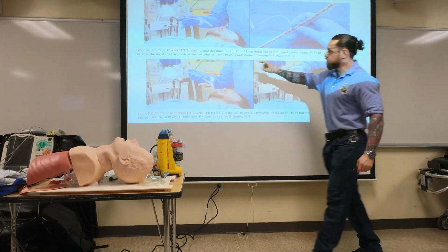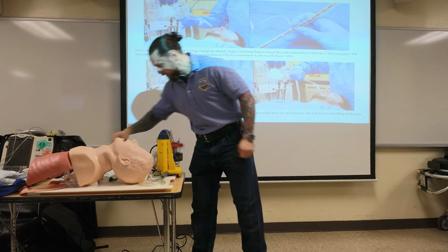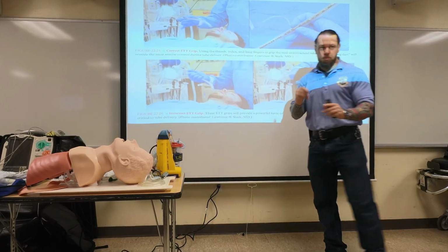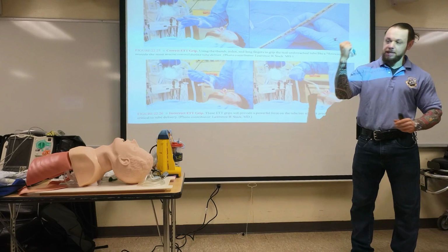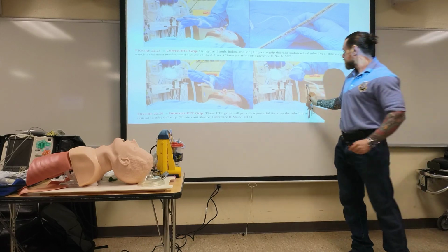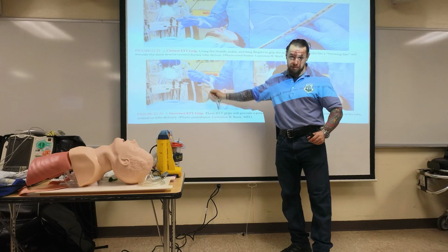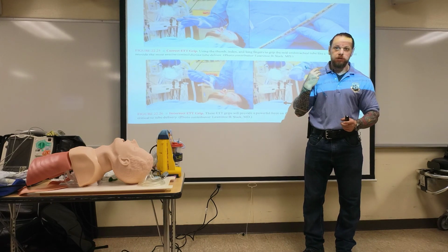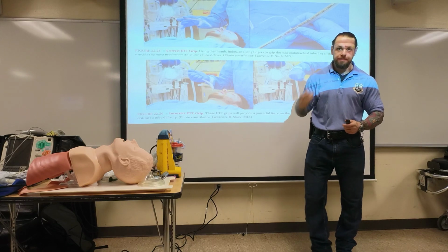So the way you hold it is, you see how it's like a dart? You're going to hold it like a dart or like a pen. Do not hold it like that. We don't jam anything. It's a fine motion. Patients have what? Soft structures. I don't want to damage anything.